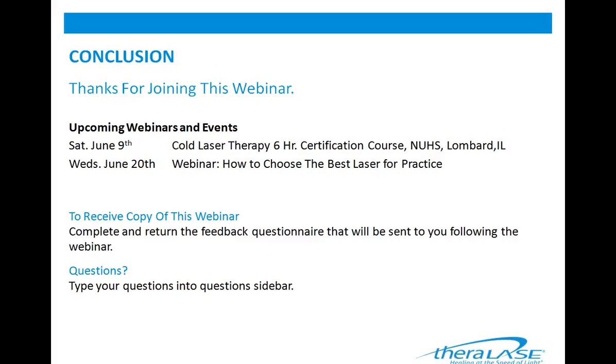Okay, that's great. Thank you. Next one is, is cancer a contraindication? Absolutely. That's the best way I can explain it. Yeah, I would agree with that. We see cancer, whether it's benign or malignant, as an absolute contraindication. There are some cancers that actually will recede with laser. The problem is that we don't know which are going to grow and which will recede, so we just say to play it safe and don't treat over any type of cancer.